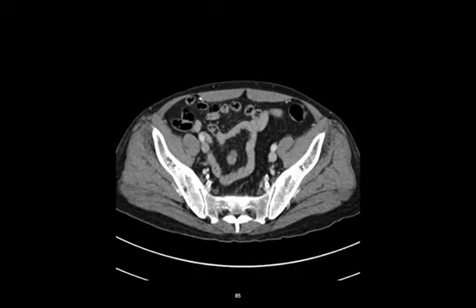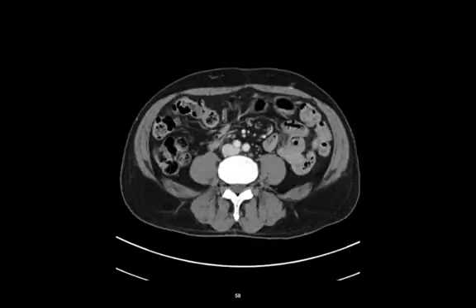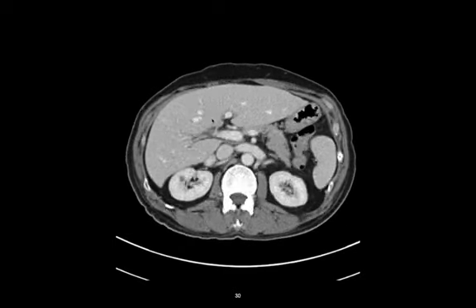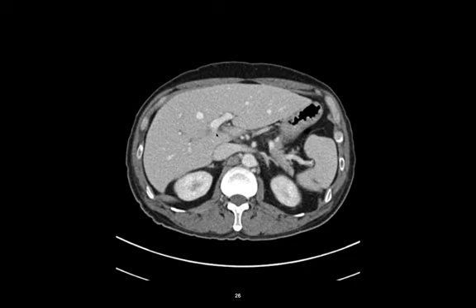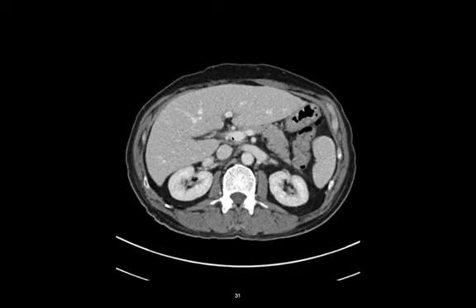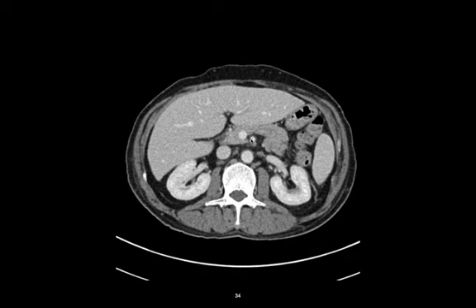Okay? All right, so next, let's talk about the hepatic portal system, shall we? The hepatic portal system is basically where the portal vein is. And so I find our liver right here, okay? And so I'm coming up, and then you're going to see this big vessel going in. That's the portal vein right there. You see the portal vein going into the different lobes of the liver. There's our portal vein, and the portal vein forms from the SMV, the superior mesenteric vein, which is right beside our superior mesenteric artery. They're both thick as thieves right there.